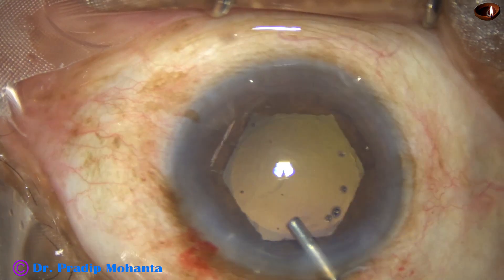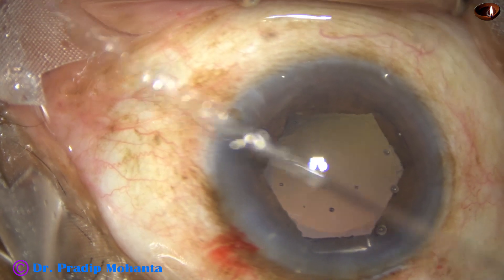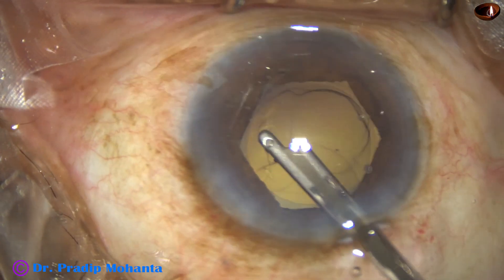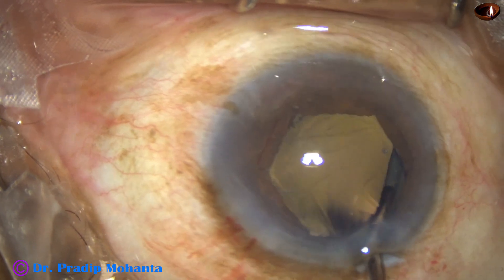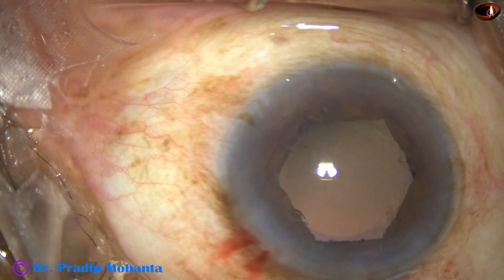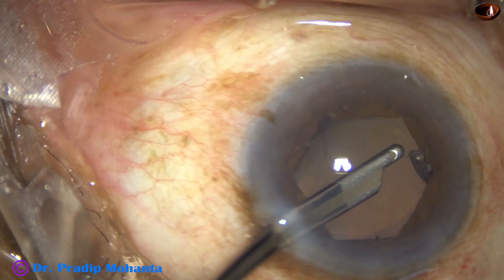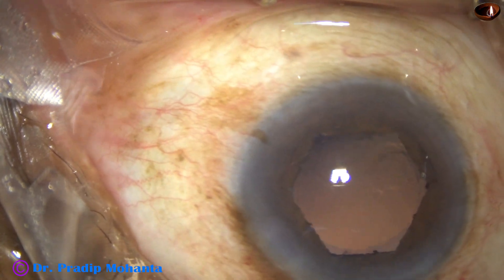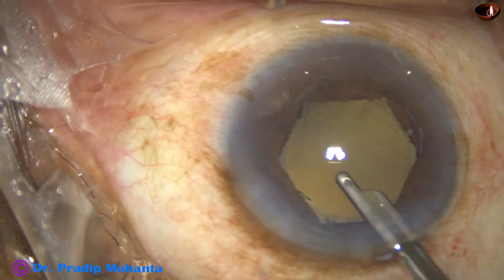Nucleus is managed. Inject some viscoelastic and I am going to use a Simcoe cannula to see if there is any cortex anywhere. There is no cortex from 1 o'clock to 8 o'clock. I go through the side port and find some cortex here, and here I find a small nuclear piece. So I escort it out and it is done.